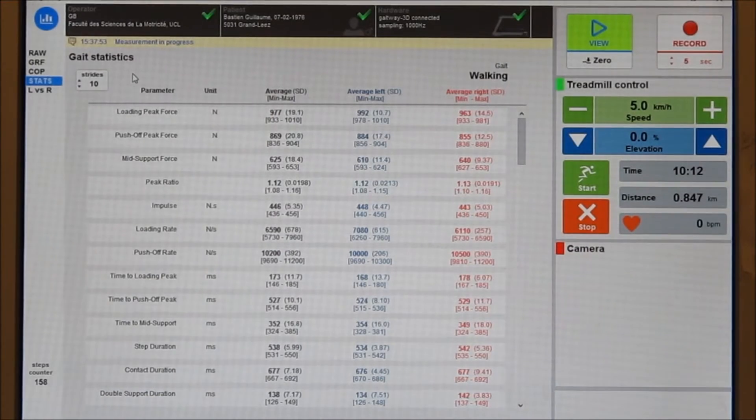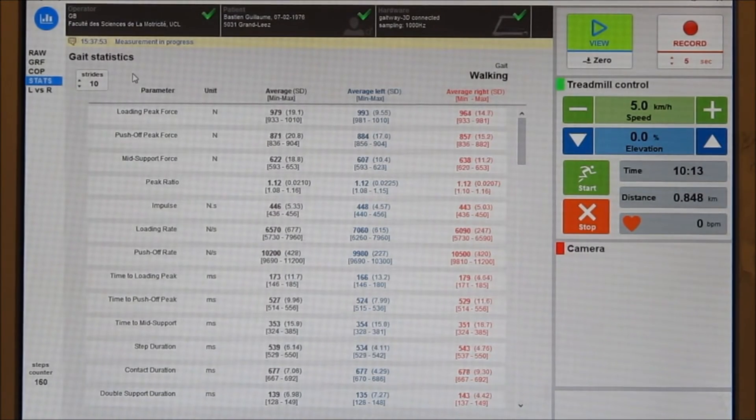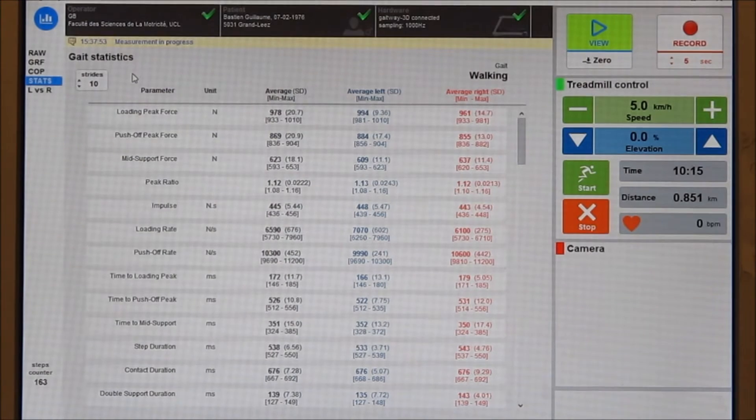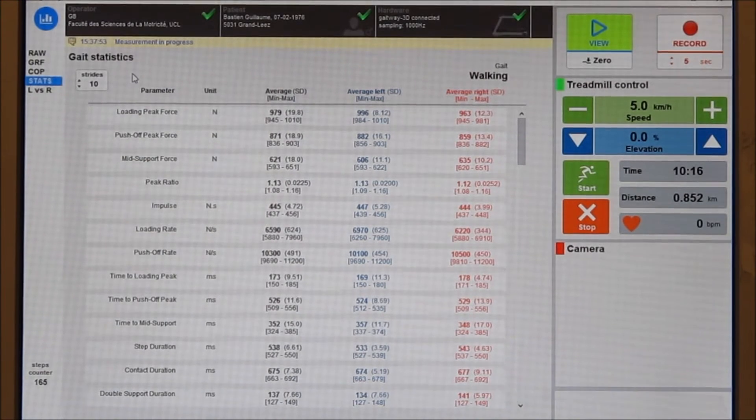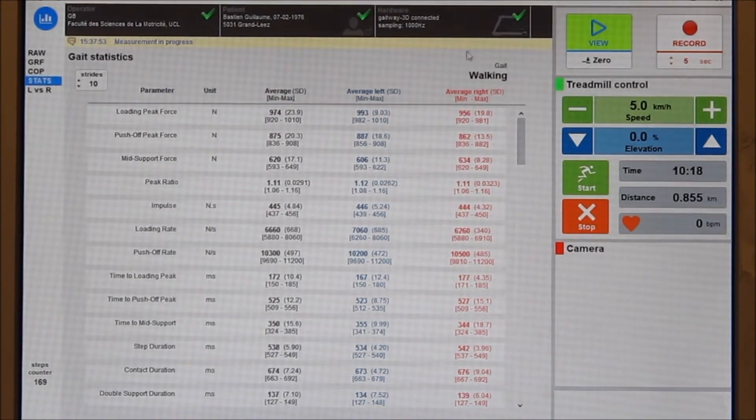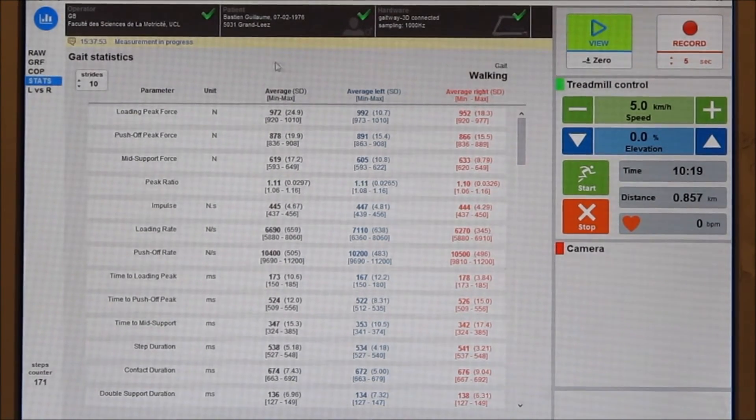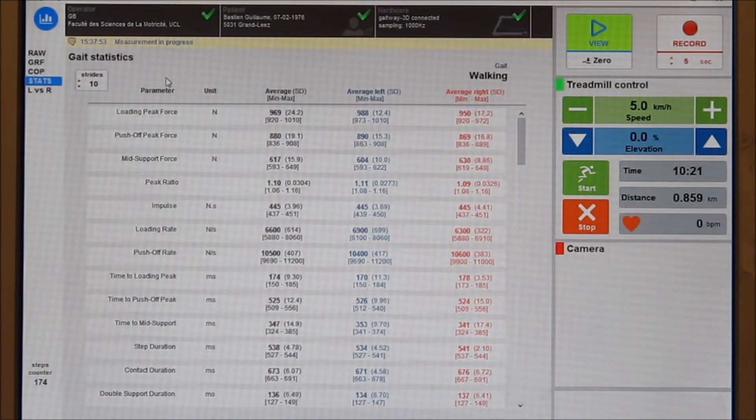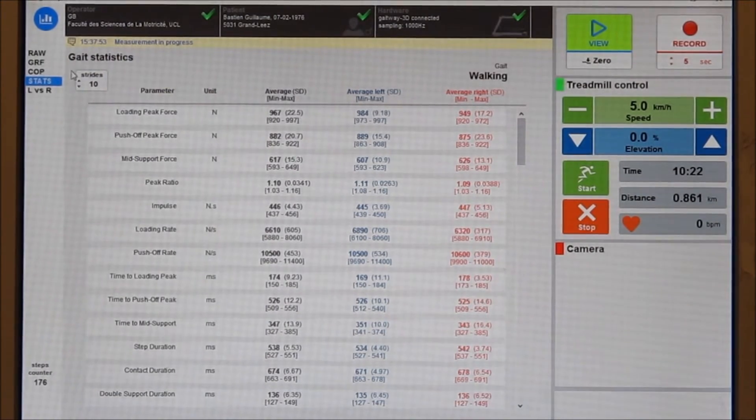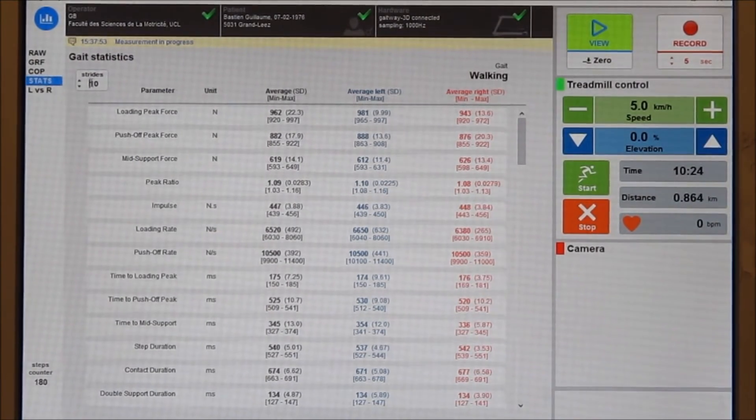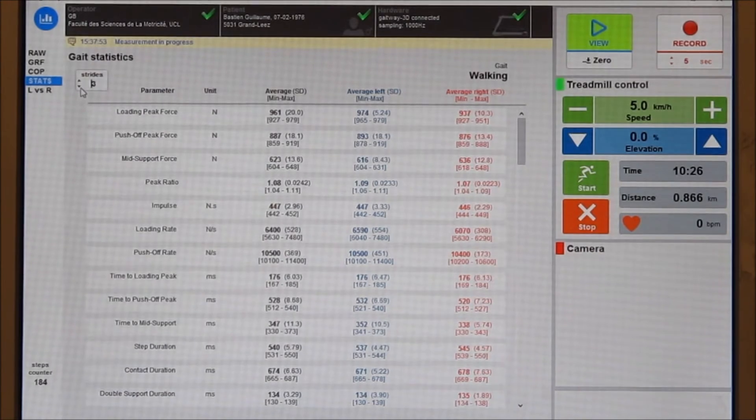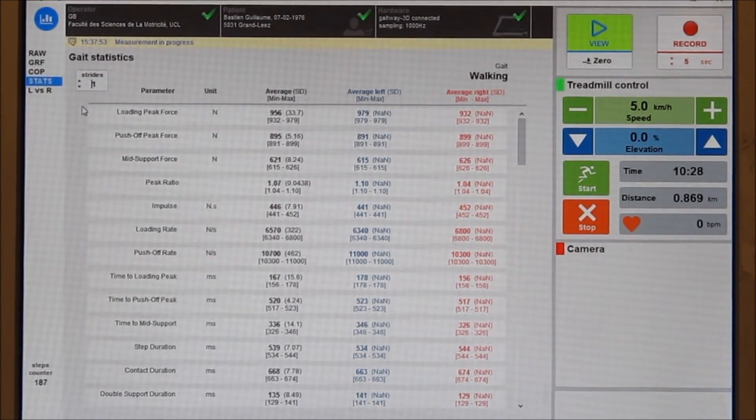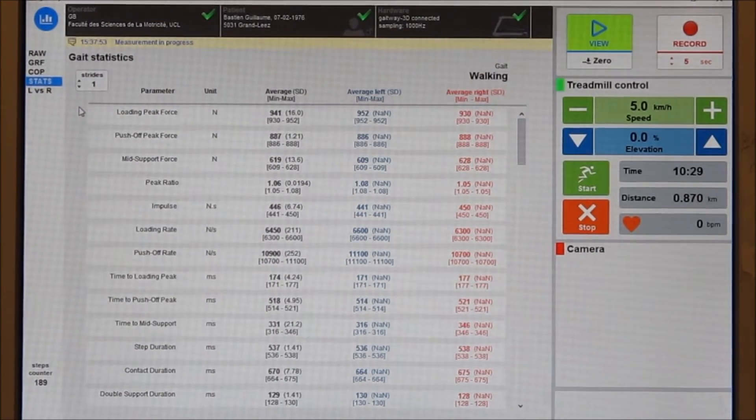The stats screen shows a number of indices computed for each step. The Gateway system automatically detects the gait. There are time and force parameters and also parameters relative to the position of the center of pressure. The parameter values are computed on the fly for a selected number of strides.